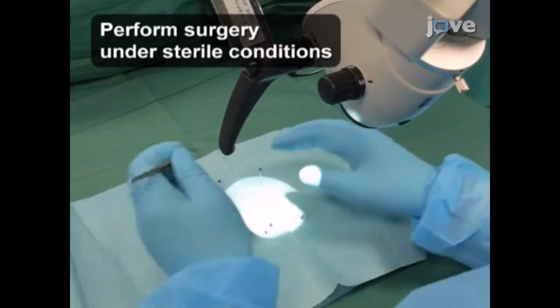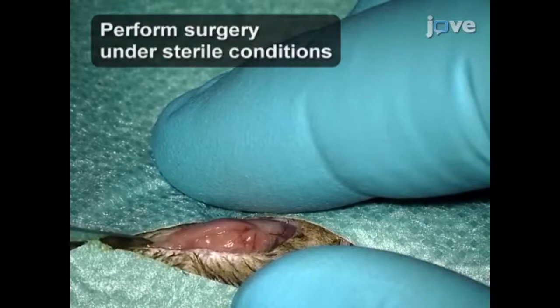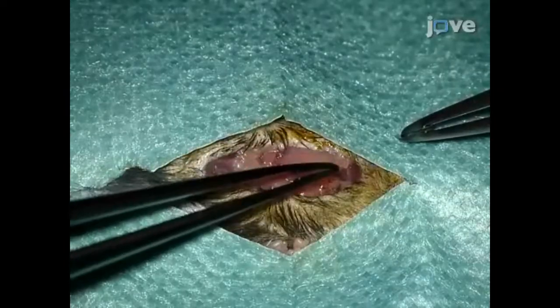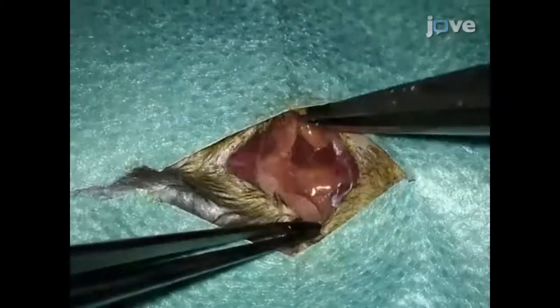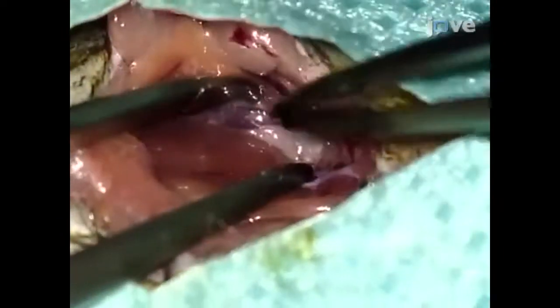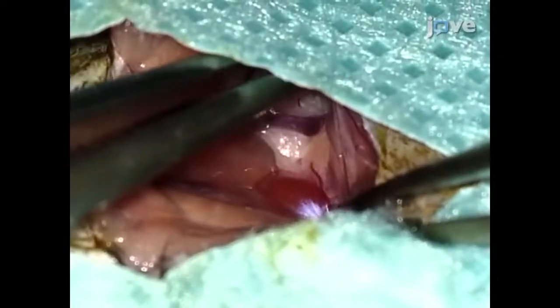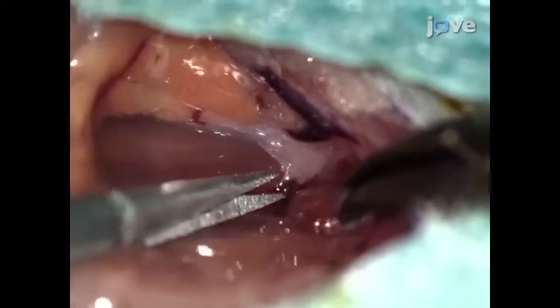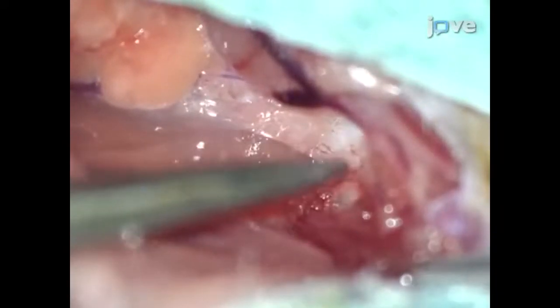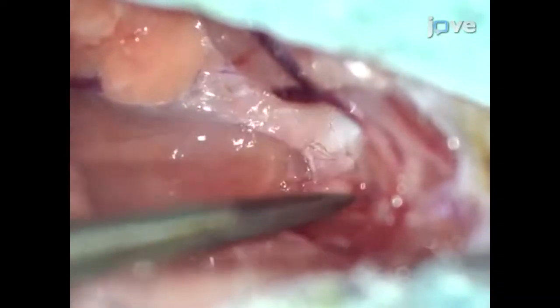After using a scalpel to make a 2 cm longitudinal incision from the mandible to the clavicle, look through the surgical microscope and identify the submandibular glands. Separate both submandibular glands with forceps, retract them, and localize the origin of the digastric muscle and the facial nerve. Next, make an incision in the origin of the digastric muscle with the scissors and retract it ventrally, exposing the underlying inferior medial aspect of the tympanic bulla.